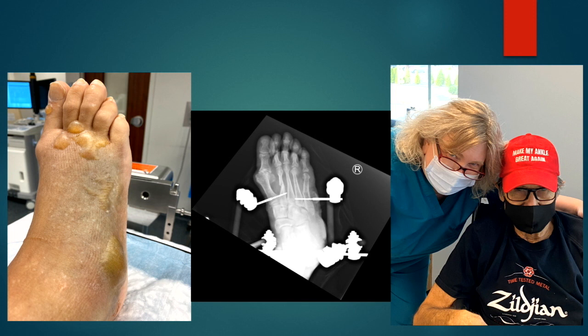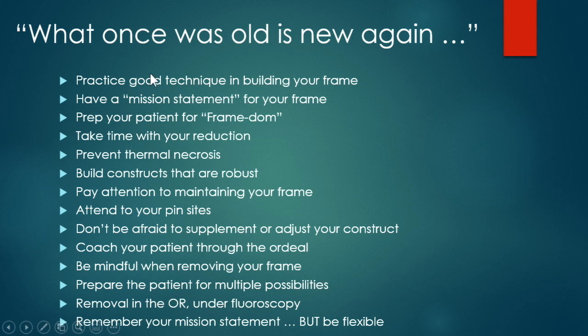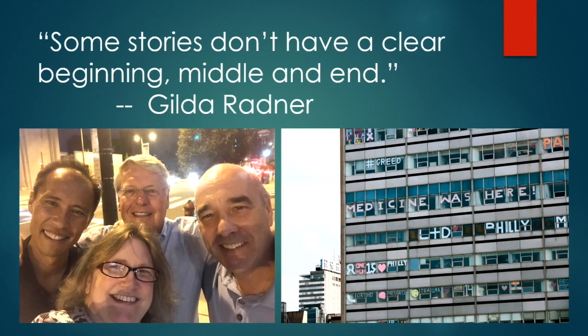So again, proper patient selection, proper frame construct, and also being willing to switch gears and do a little hybrid stuff as you need to is probably the best advice I could give you when you're considering long-term frame stabilization. So what once was old is new again. These are all of the things we discussed, and these techniques keep coming back over and over again as you play the game of orthopedic trauma, and that's, again, the beauty of it, in my opinion.